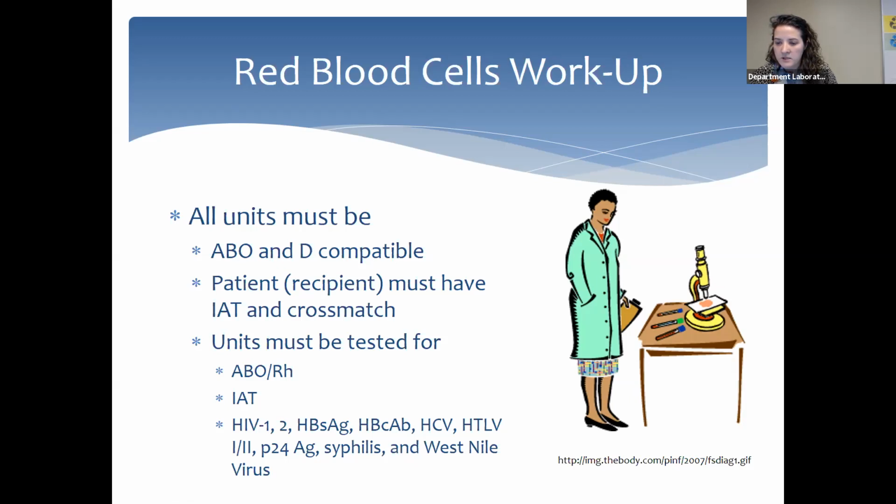Sarah asked, what is that, like HCLL? Oh, yes, that would be your blood bank system. Yeah. Blood bank systems, I probably can't think of any off the top of my head. Citrix. What's the older one you used to use? There are several different blood product management systems. At UAMS, they had their blood product management system, and then they had their electronic medical records, where all the patient history is located. The two did not talk to each other. So you would have to look in Epic for your patient history, diagnosis, and all that stuff, but your lab results were entered in, I can't even think of what system it was. It was in the other system.